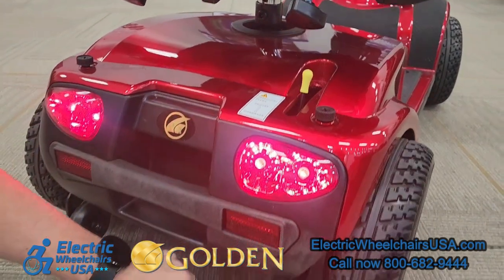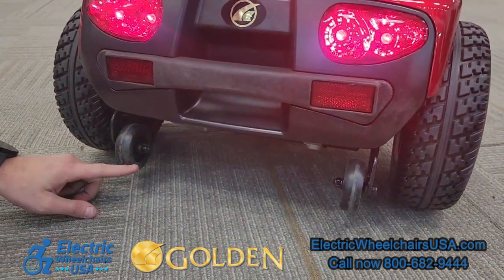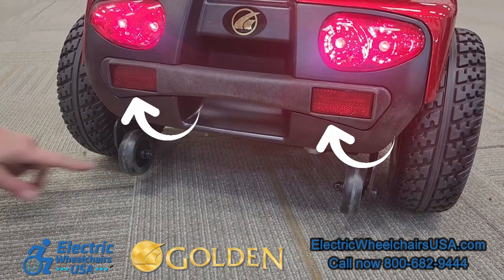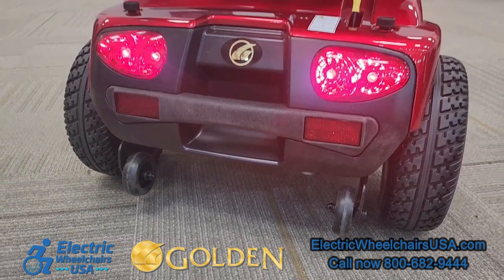On the back of the chair, there are two rear anti-tip wheels. This is an added safety feature for if you're going up a steep incline — it just prevents you from tipping backwards. There are also two rear reflectors, and above the rear reflectors are the two rear taillights, which illuminate once you turn on the lighting package.